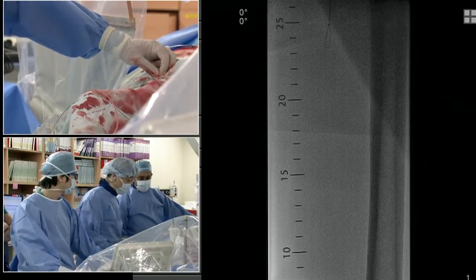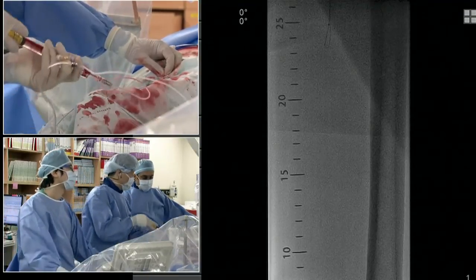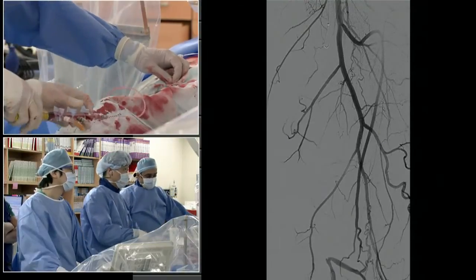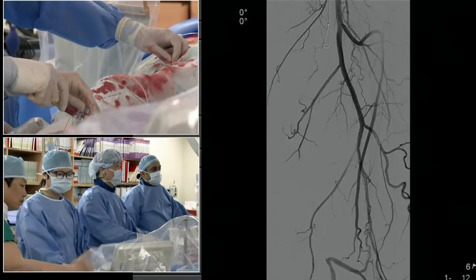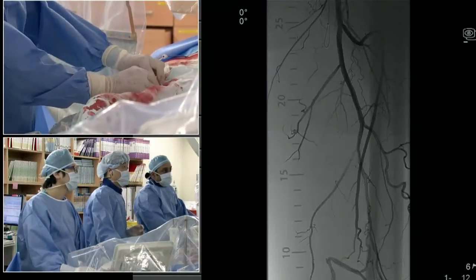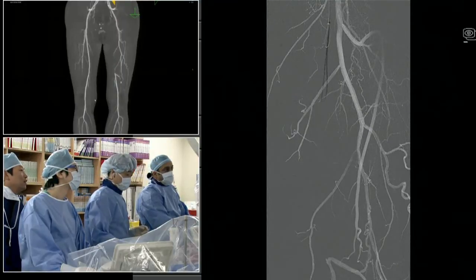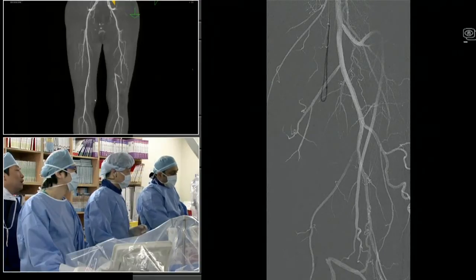It's interesting as we look at this case, unlike anything in coronary intervention, everybody on the panel's already accepted the fact there will be a failure mode. In other words, the patient probably will restenose, and if you want to look forward in terms of how you're going to treat that restenosis, focally stent with a drug-eluting stent, drug-eluting balloon, or a covered stent, whatever, because realizing that unless you can get this patient to stop smoking and start exercising, even if it restenoses, he may not have symptoms, we're not going to change his overall arteriosclerotic problem.